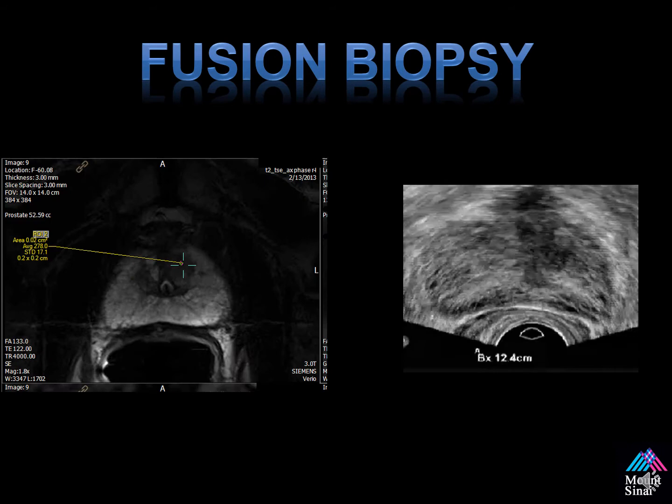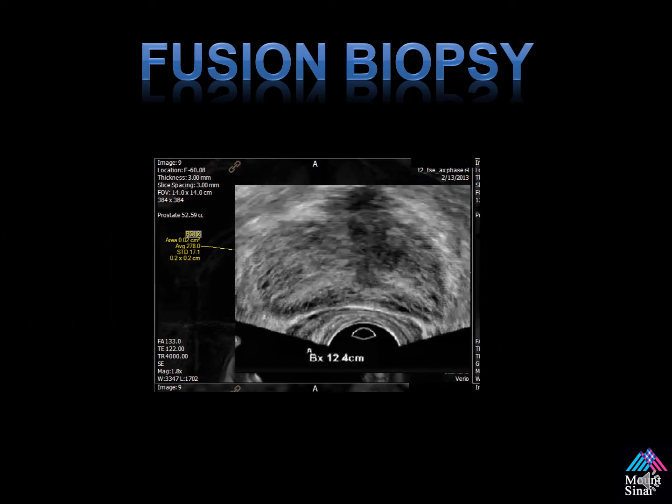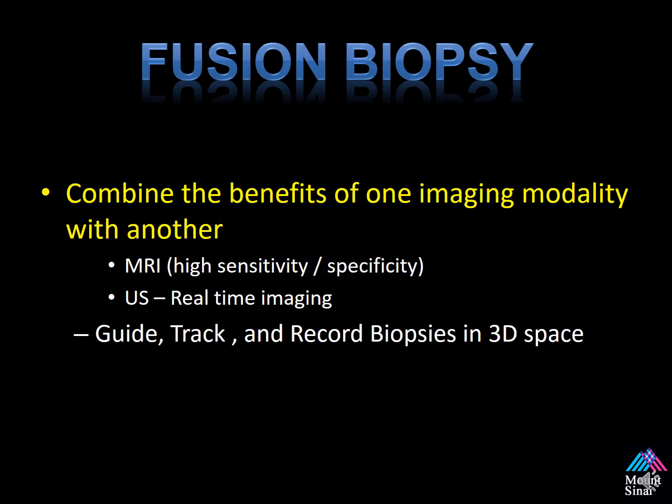What is fusion? In its simplest terms, it's the ability to combine two data sets together — your ultrasound, as seen on the right, and the MRI on the left — and overlay these in 3D space. We use the benefits of the MRI with its high sensitivity and specificity for detecting prostate cancer, and the ultrasound for its easy use and ability to do real-time imaging. It allows us to guide, track, and record biopsies in 3D space.